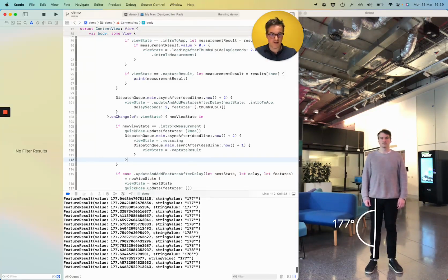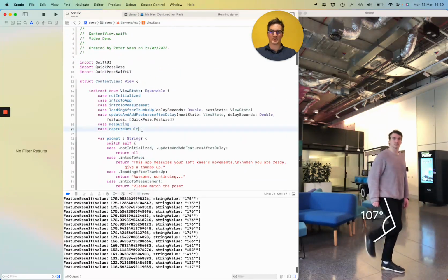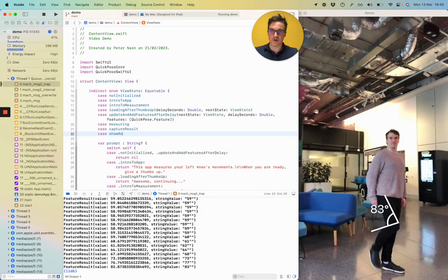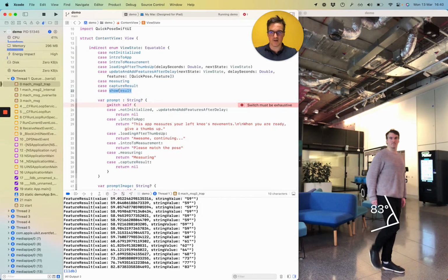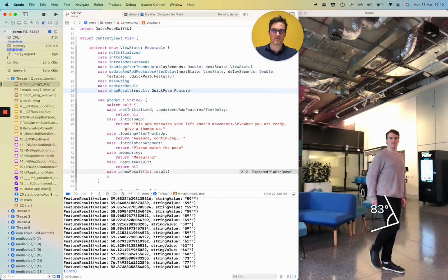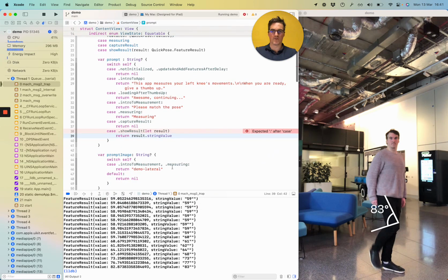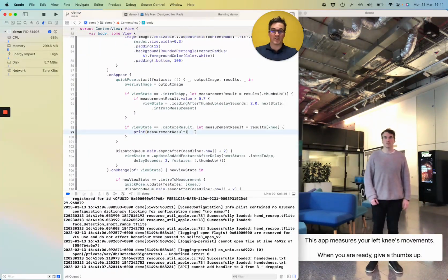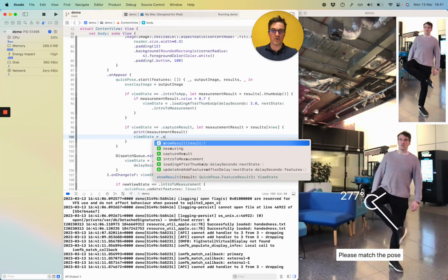Cool, okay, well, we're getting a big load of values there. And now let's have a state called show result. So it's just going to stay in this forever. I might actually pause him. So we're going to show the result. Tweak prompt to have show result displaying a string. Let's just see how that would work. For now, we'll store the result inside here. So this would be a result, and it would be a feature result from QuickPose. Just return results and then string value. Okay. And then after we've caught a valid value here, I'm going to just save that result. So view state becomes show result with our measurement result in.